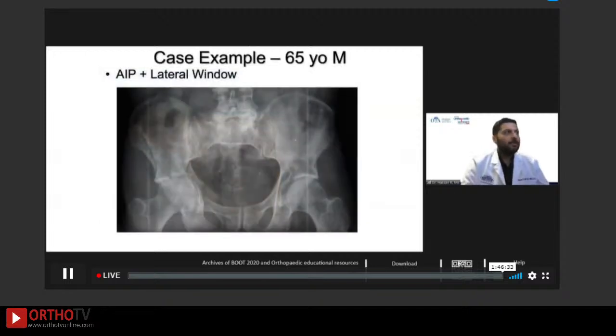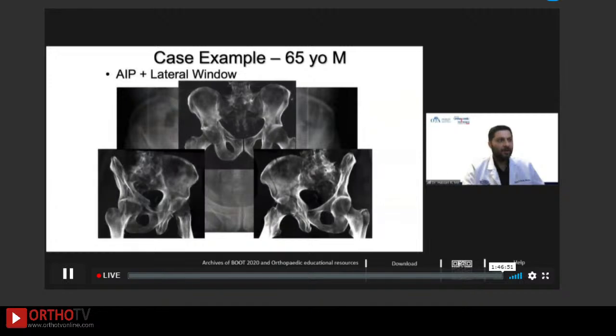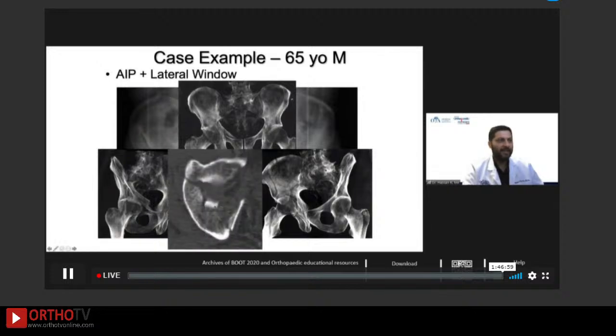All right. So just a few quick case examples to show what can be done through the AIP and lateral window. So this is a gentleman, 65, who fell from a ladder and has this anterior column posterior hemitransverse fracture with a dome impacted segment. Here you can see on the ghost reconstructions from the CT scan, again, the fracture pattern there. And then here you can see the impacted dome segment is visualized.